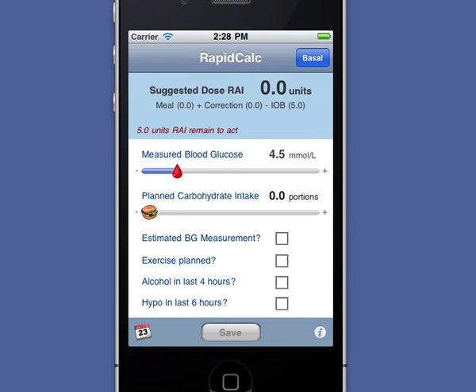RapidCalc helps in several other ways too. For basal dosing, RapidCalc will remember up to three standard doses — one for each part of the day: morning, midday, and evening.